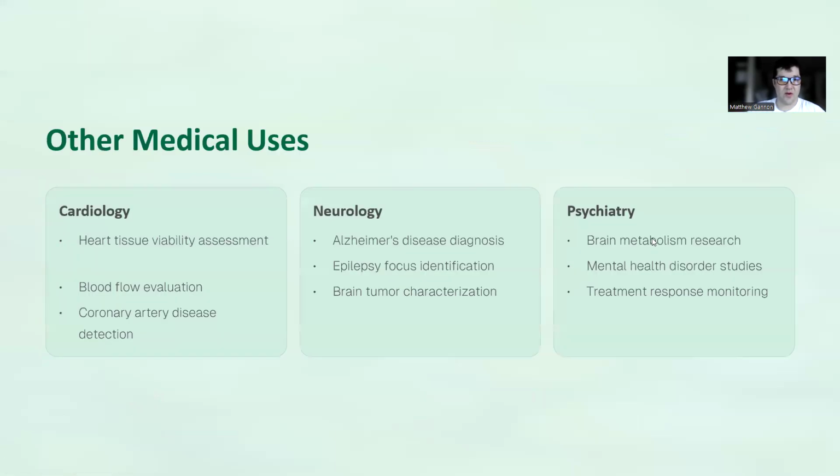Okay, other medical uses: cardiology. They've been finding out that even cancer affects the heart in different ways. So they're trying to figure out how to use PET-CT to diagnose hearts and find hotspots.